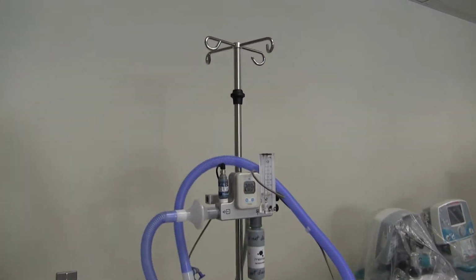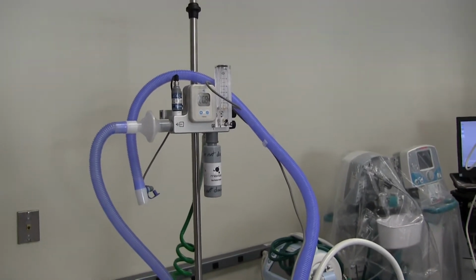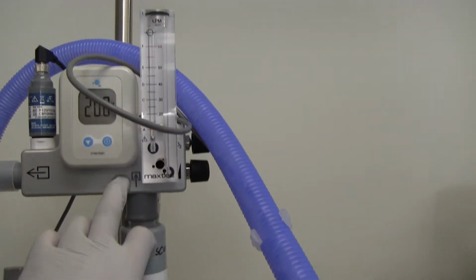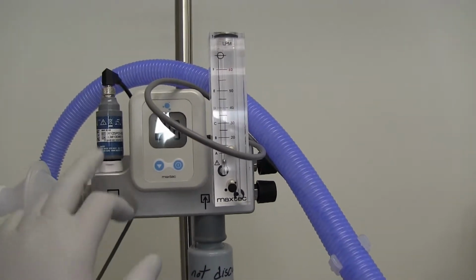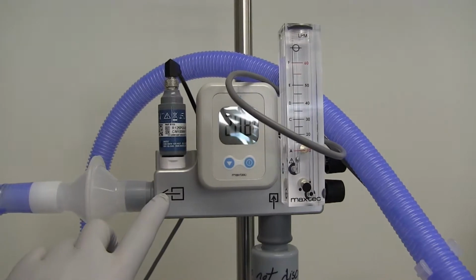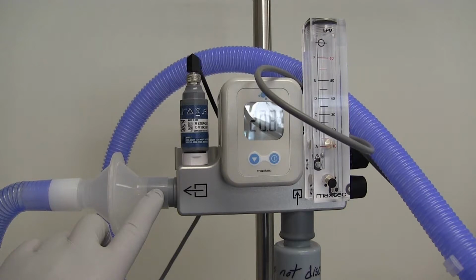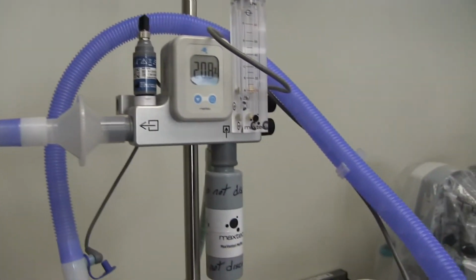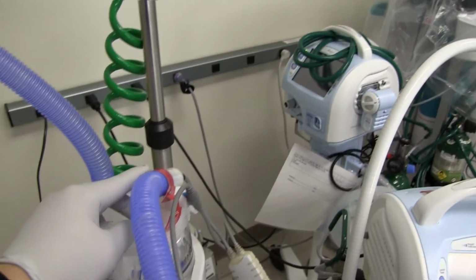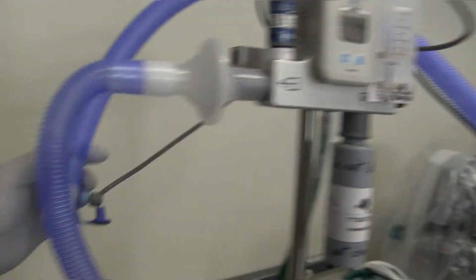Alright, so we've made it over to Grady. Here is a high flow nasal cannula setup as it is on the pole. Right here we have your high flow meter, which is already pre-attached to your blender, and then you have your oxygen analyzer, which is the probe that sits in line, so you can follow the flow. You follow the flow out, coming out from your blender, out to your dry side of your circuit, down to your humidifier chamber, and then you're going to have your wet side, which is a longer circuit, as you can see here, and it goes all the way up and ends here.